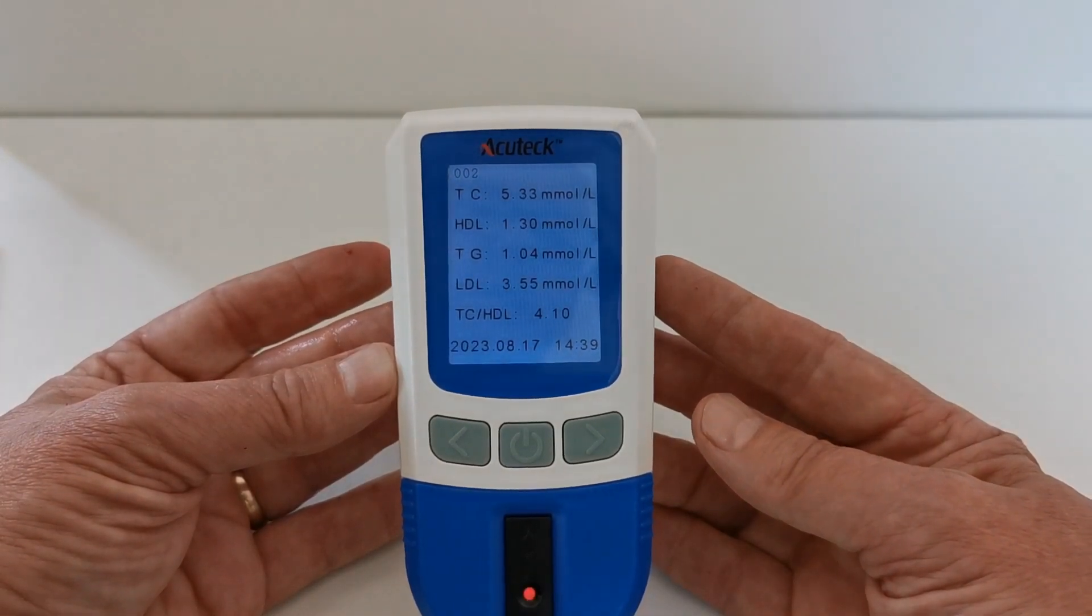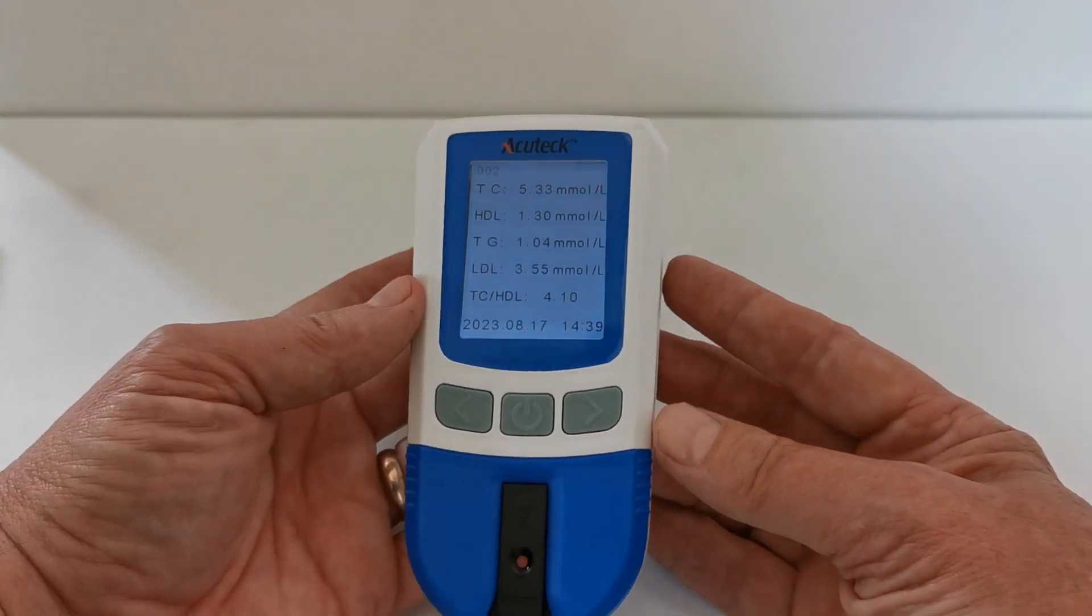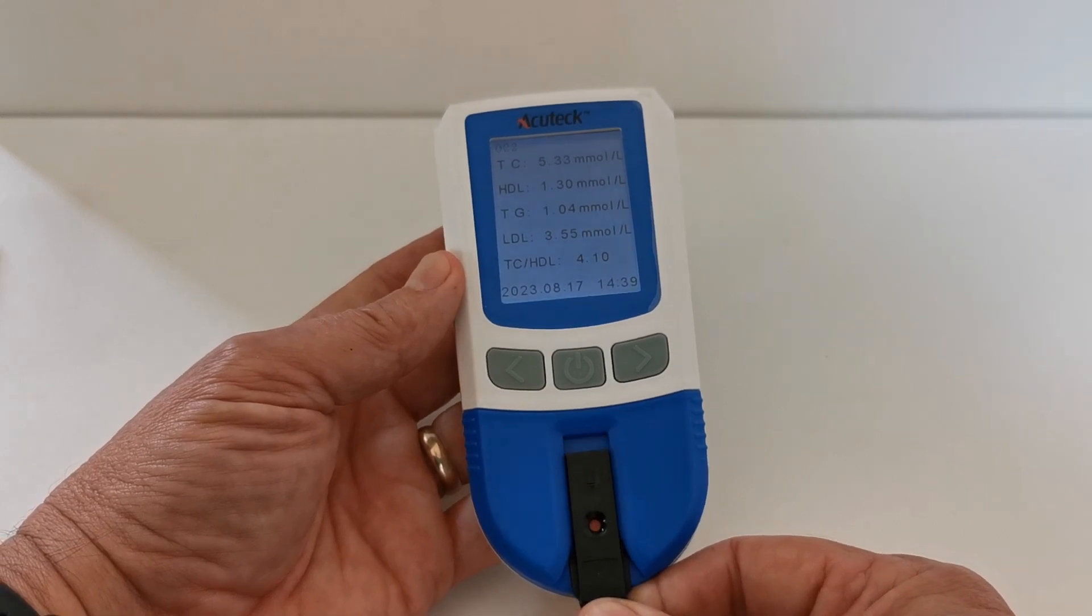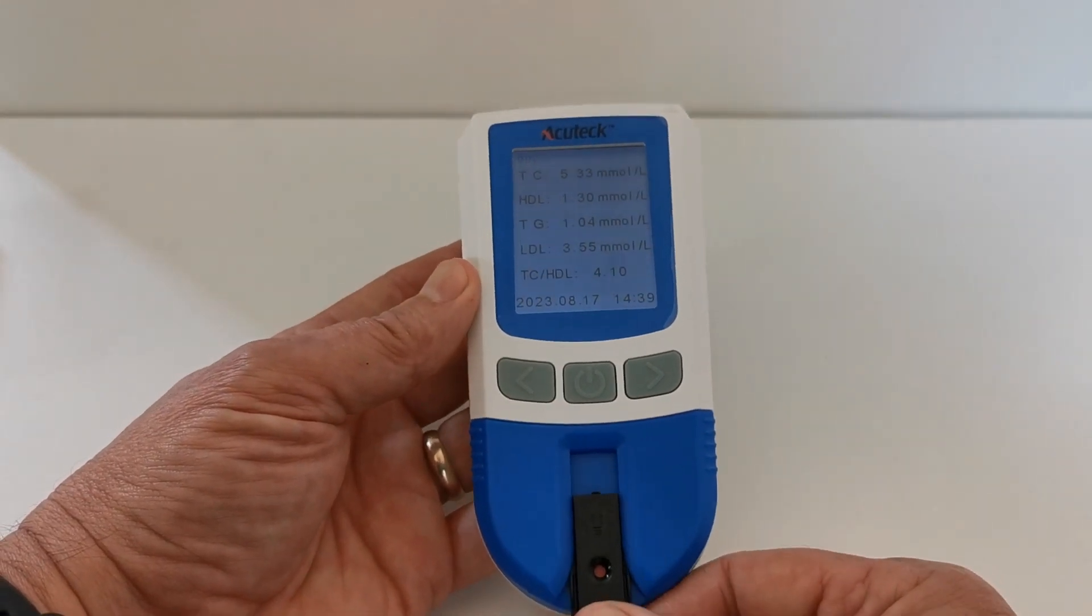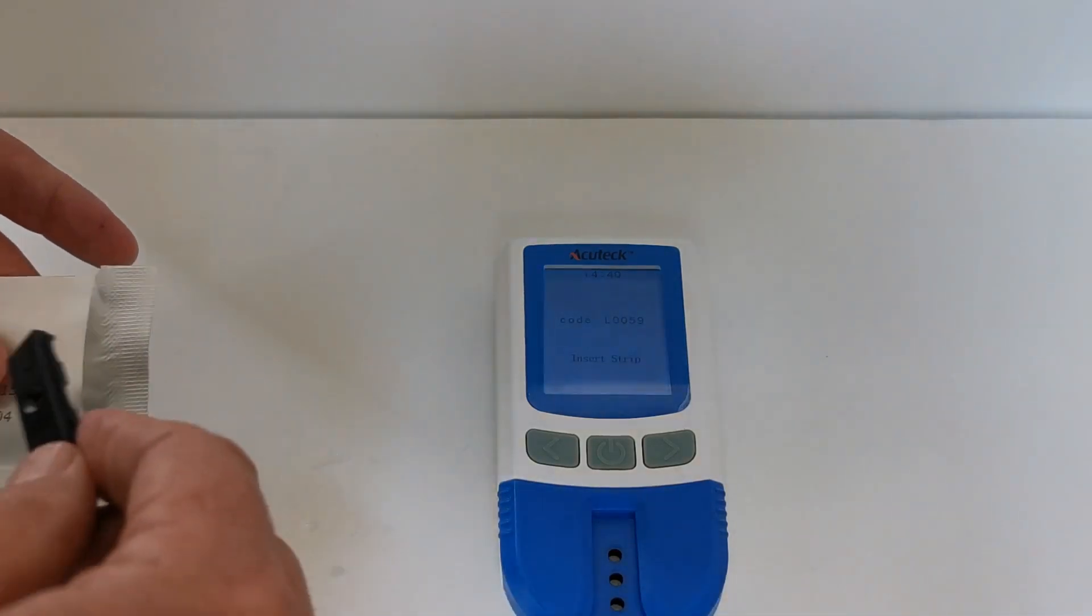Now the meter will automatically power down after 5 minutes. But you can now remove the test device and that can be placed back into its foil for disposal.